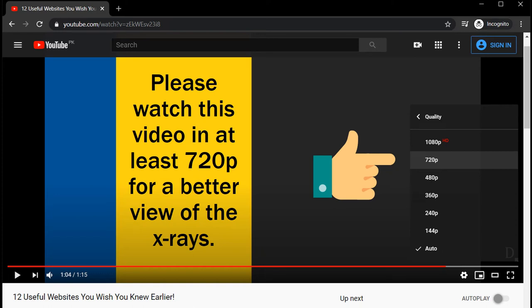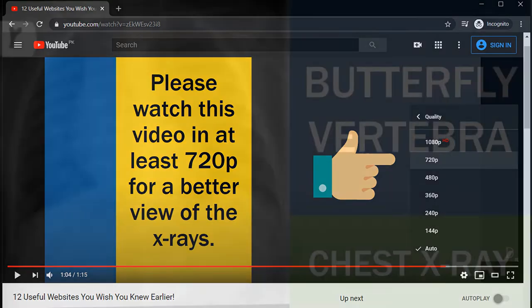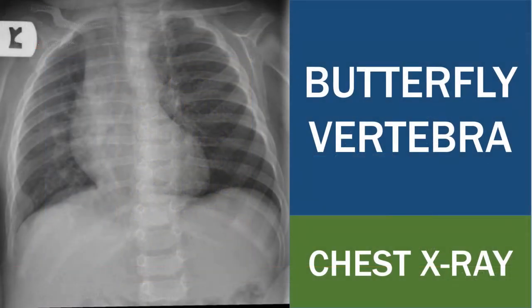Please watch this video in at least 720 pixels for a better view of the x-rays. Butterfly vertebra in chest x-ray.